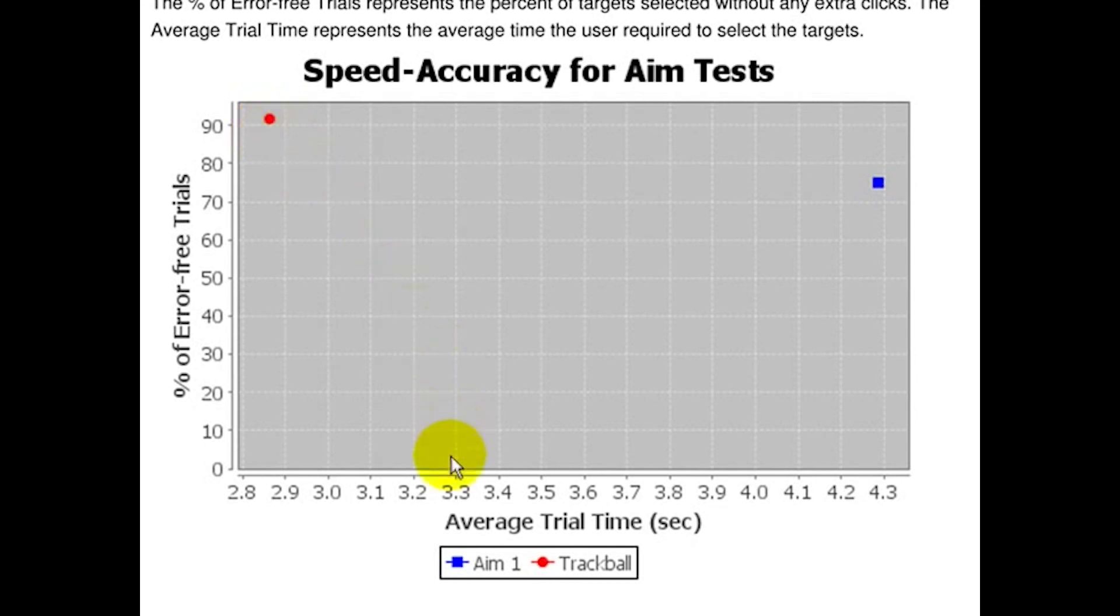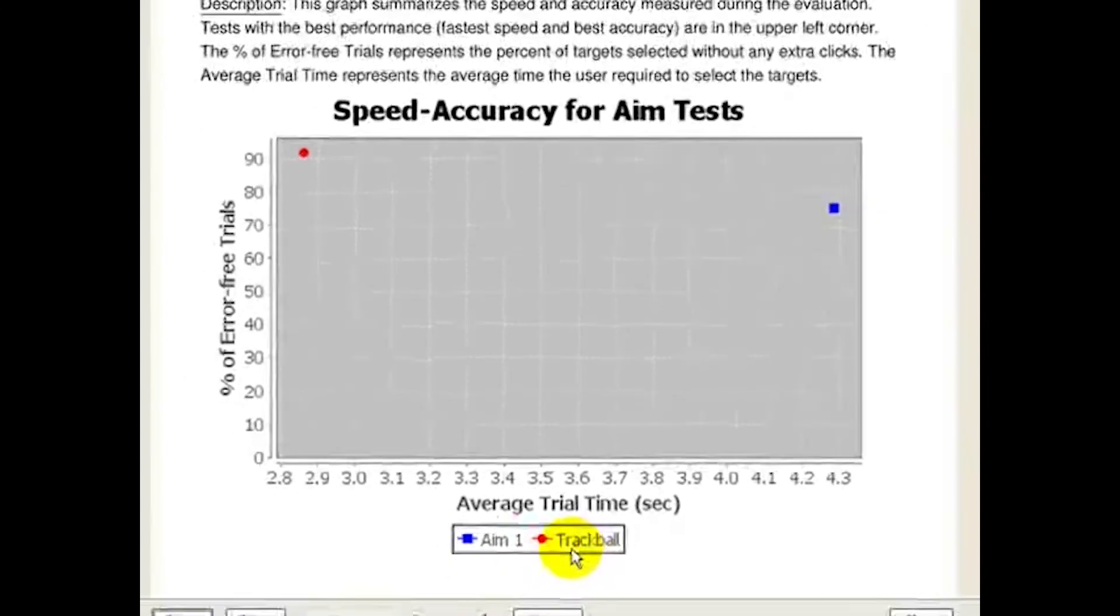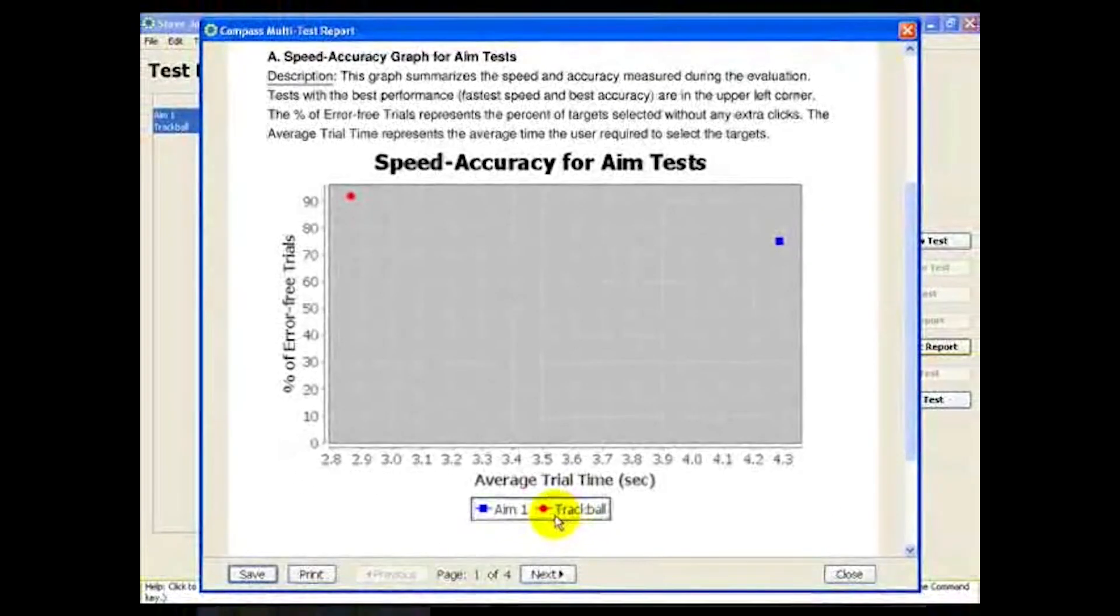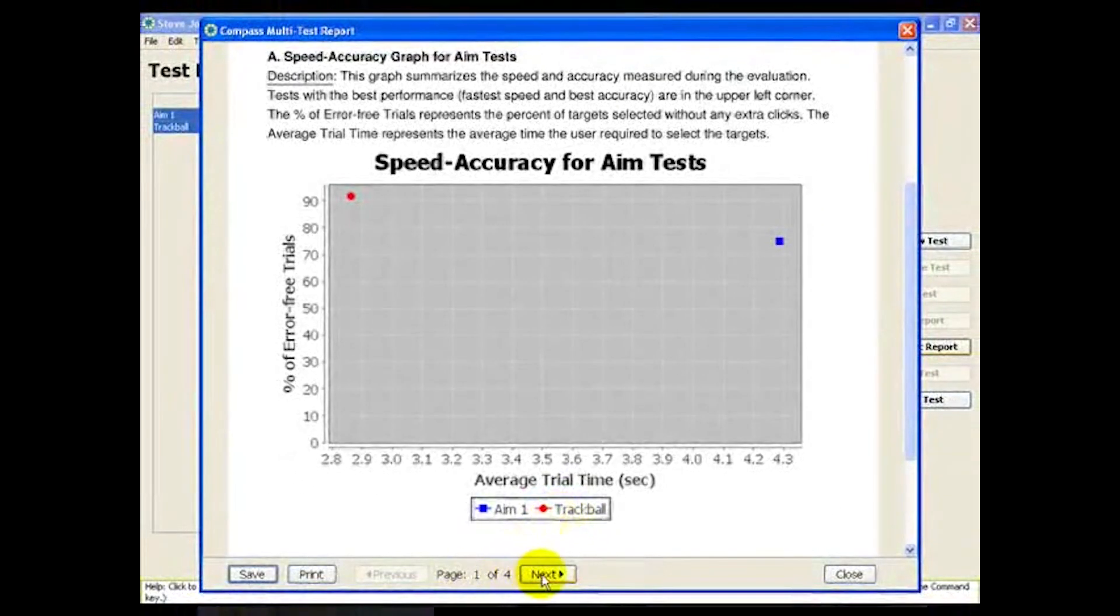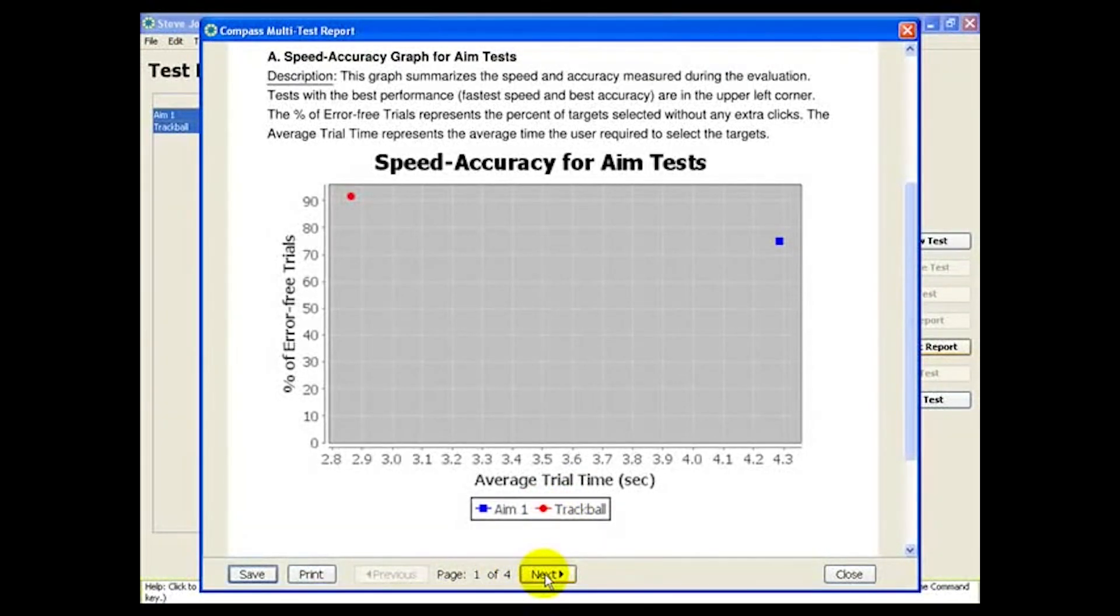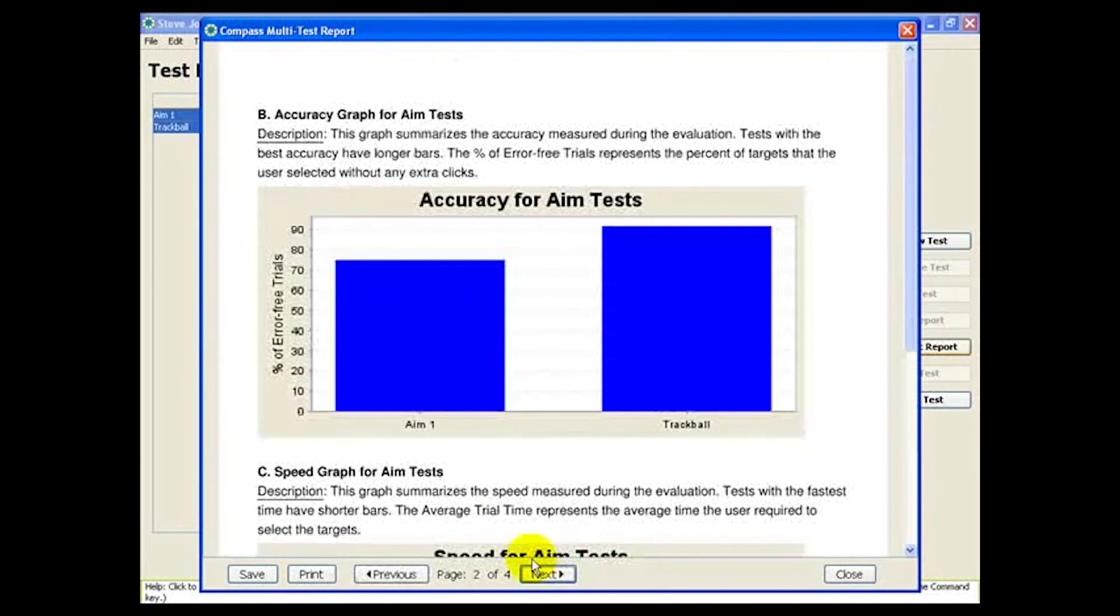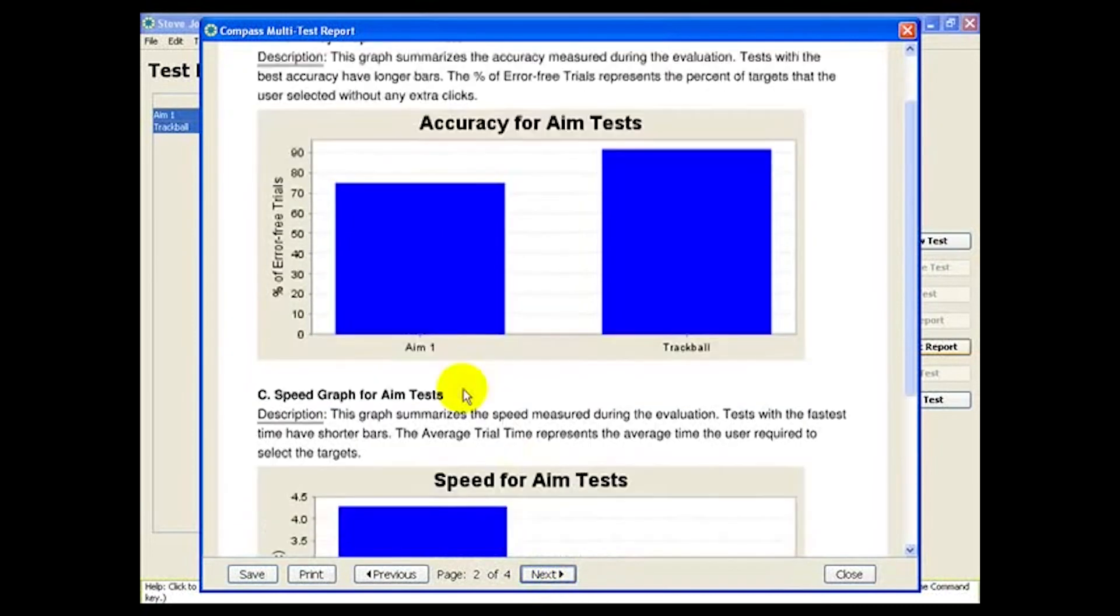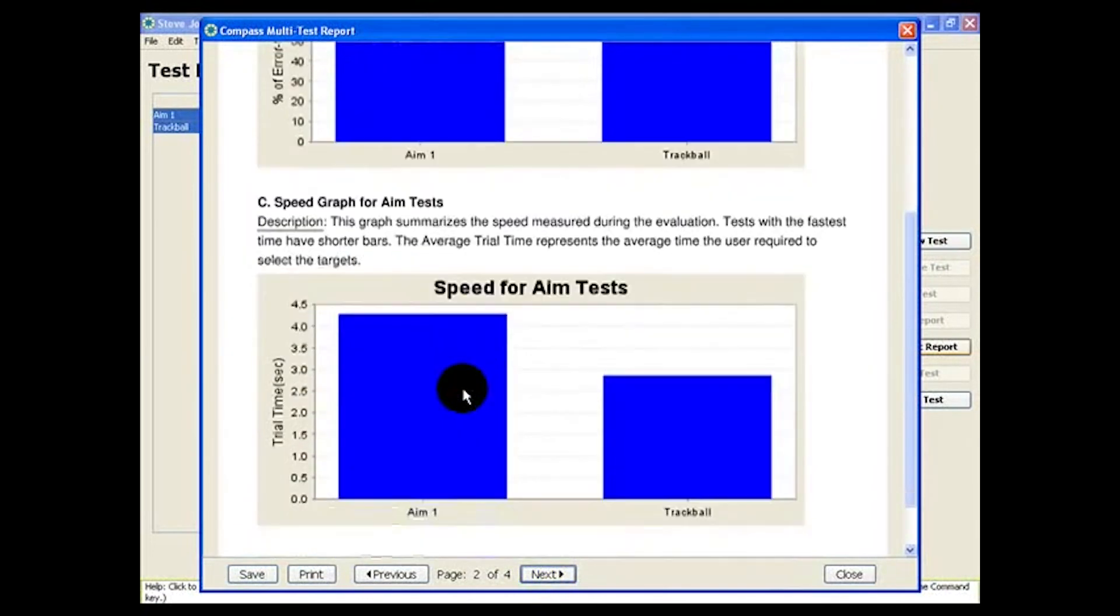If you want to change the test names, you can do that when you configure the tests initially, or in the single test report screen. The remaining two graphs on the report show accuracy and speed separately.